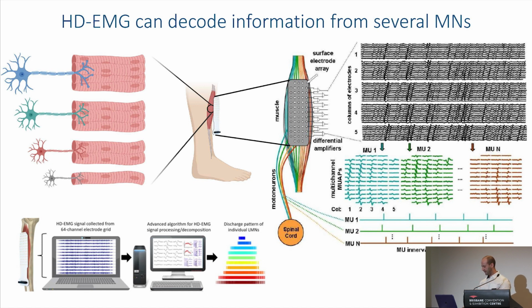As you can see here, the red or warm colors are the lower, smaller type of motor neurons. The cold colors are larger motor neurons. Each color represents a firing. You can't see it here because it's really small, but it's a raster plot, so it has a lot of dashes. Every time the motor neuron fires, you see one of those points. So if that happens more, it means it's firing more.